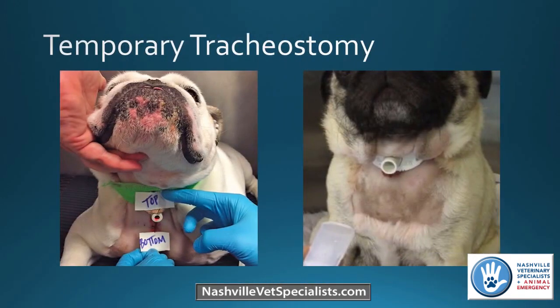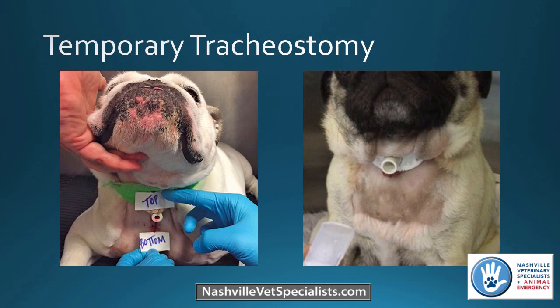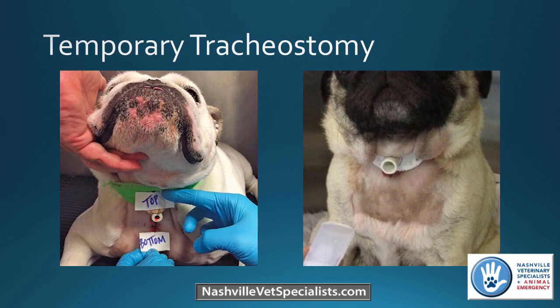Complications include hemorrhage, damage to the recurrent laryngeal nerve, accidental puncture of the endotracheal tube cuff if already intubated, obstruction if the tube gets clogged, tube dislodgement, infection and pneumonia — since there's a larger hole going directly into the lungs — subcutaneous emphysema, and injury to the trachea itself. These pictures show an English bulldog and a pug as examples, showing the up and down stay sutures for quick tube replacement if needed.